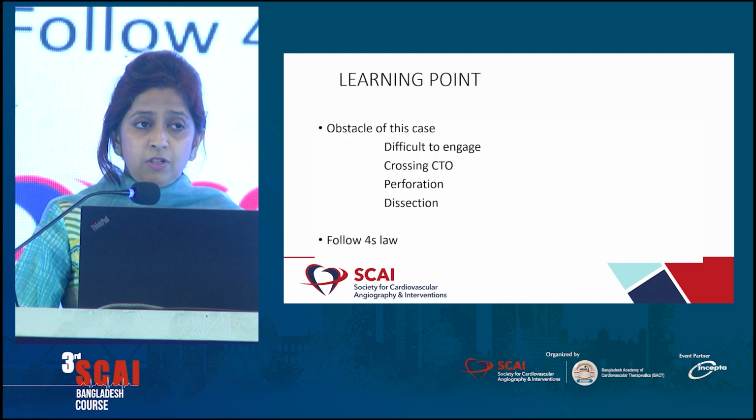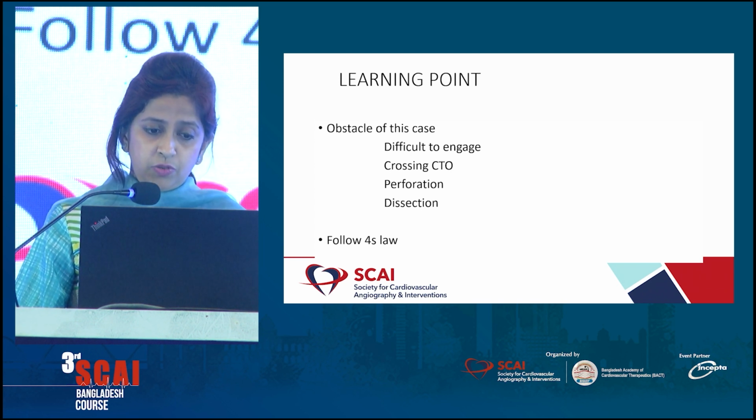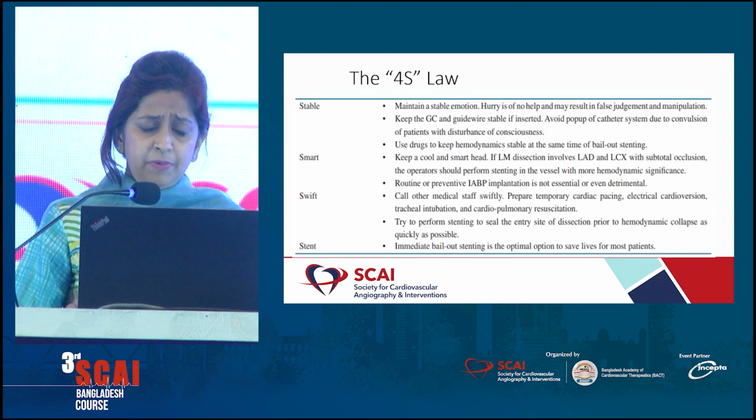So the learning points: there were a lot of obstacles in this case. There was difficulty in engagement, then crossing the CTO. After crossing, there was perforation. After we sealed the perforation, there was dissection. In this type of case, we should follow these golden rules.